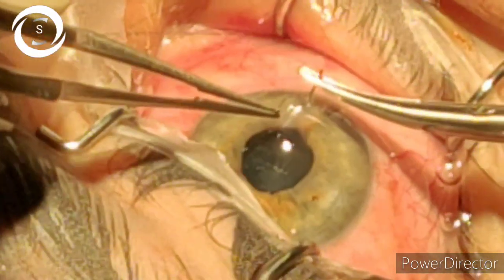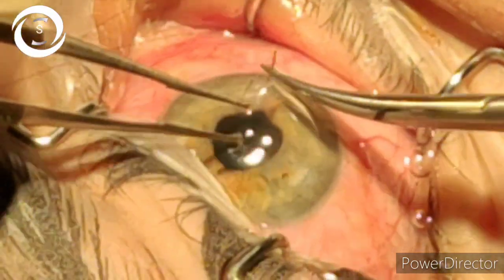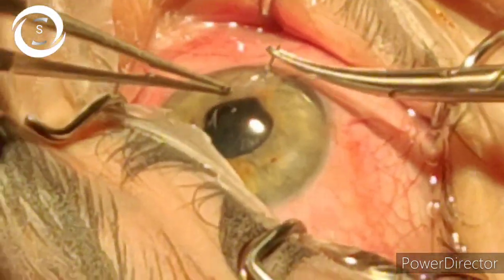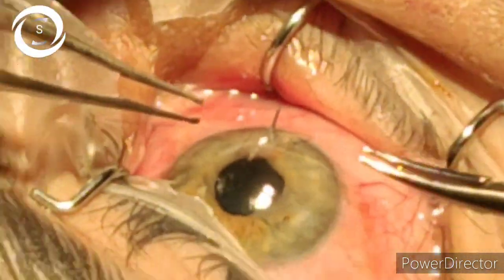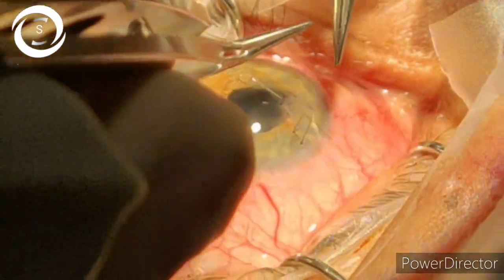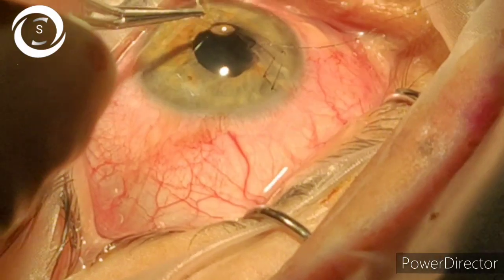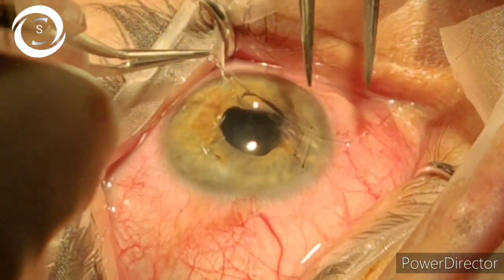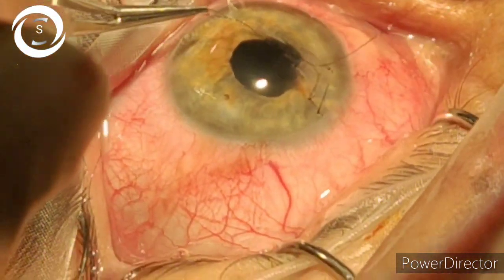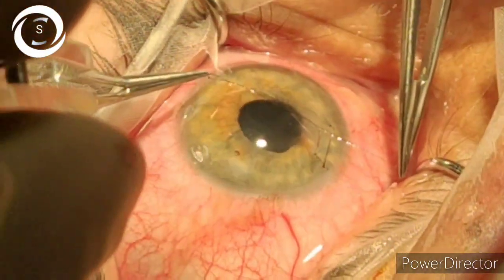For the fourth suture in total — the second vertical suture — I aligned the cameraman so it could be easily captured. I am coming just up to the margin of the inferior pupil. The challenge is to pass the suture into healthy cornea so that it should not cheese-wire, and you have to go as inferior as possible so that the suture does not obstruct the pupillary visual axis.